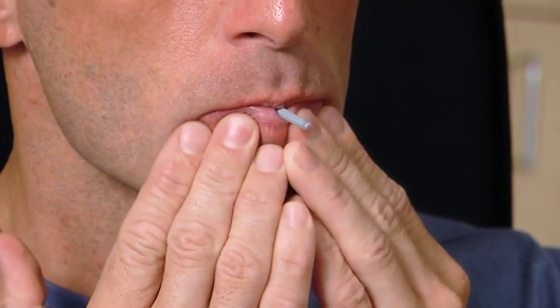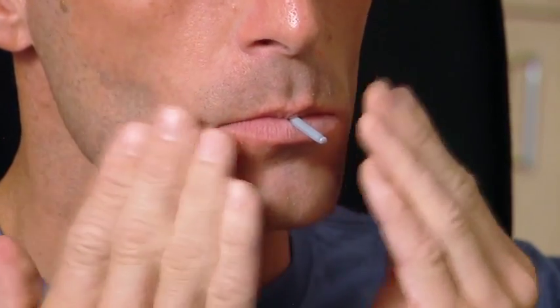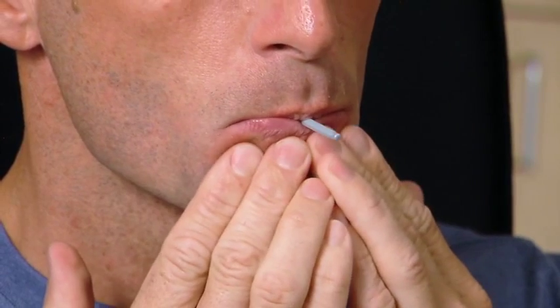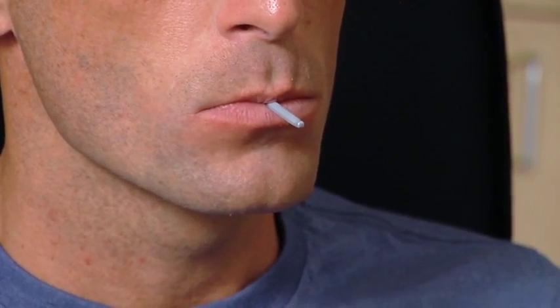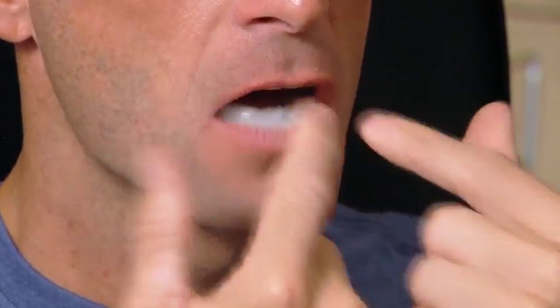Press your fingers below your lower lip and against the front part of the tray along the gum line and lower teeth. Use your tongue to press against the inner side walls of the tray. After 1 minute, use your fingers to smooth out any excess material to create a flat surface over the molars. Allow the tray to cool on the teeth for an additional 3 minutes.